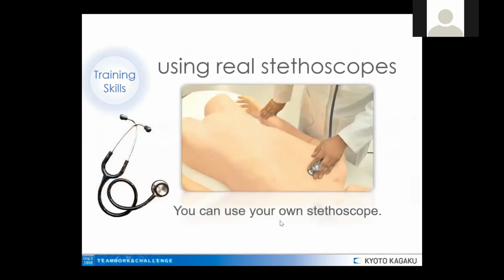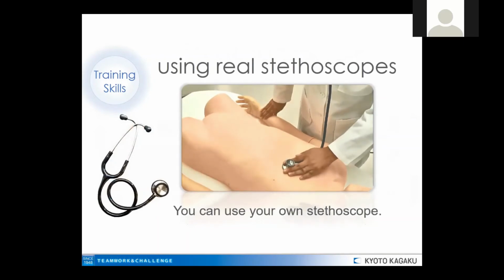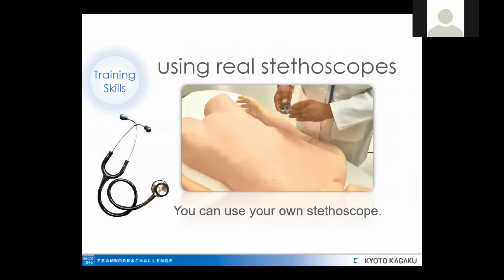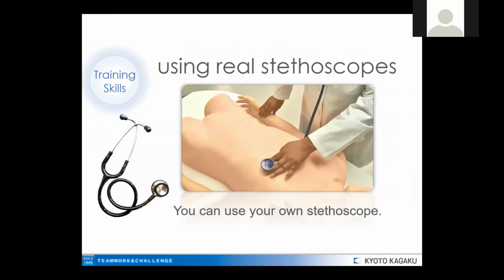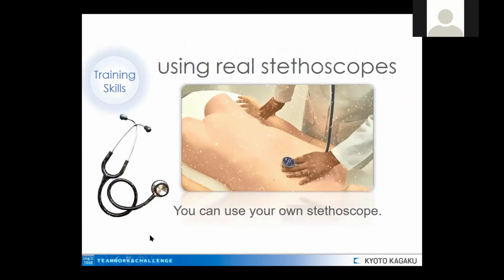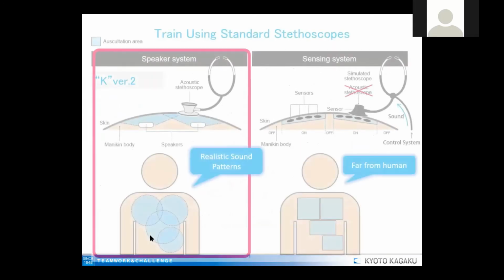And here there is also one more point to emphasize, and that is that you can use your own stethoscope. There is no simulated stethoscope. This model allows the practice with a real stethoscope, which is also very important. There are many models in the market with just a simulated stethoscope, but those are not very real.